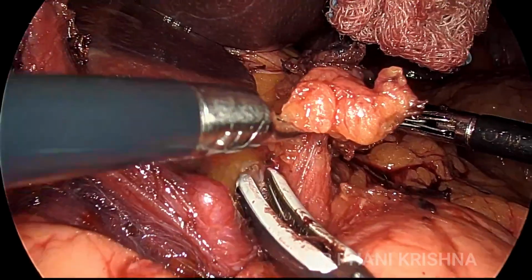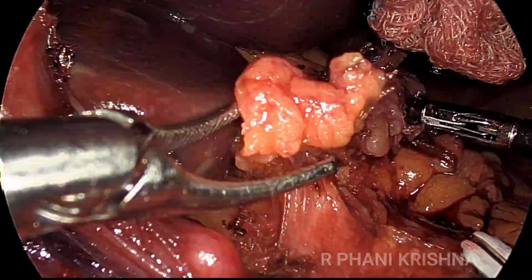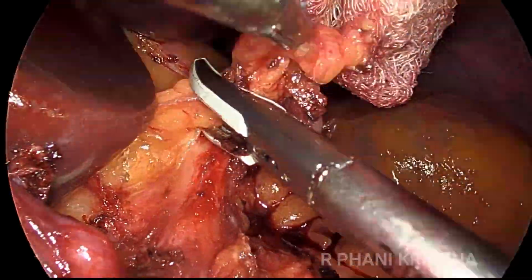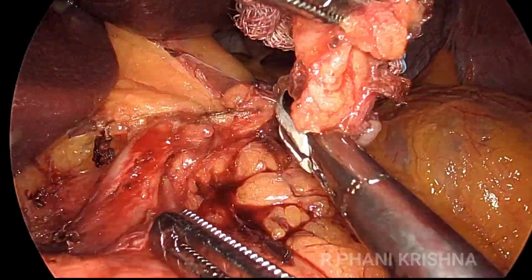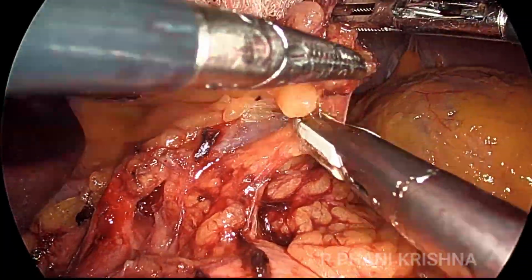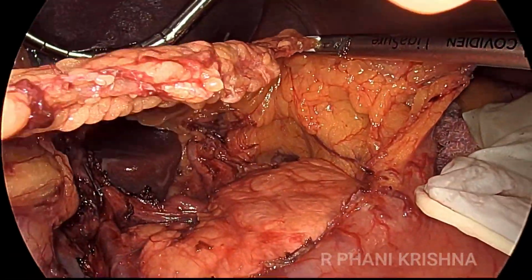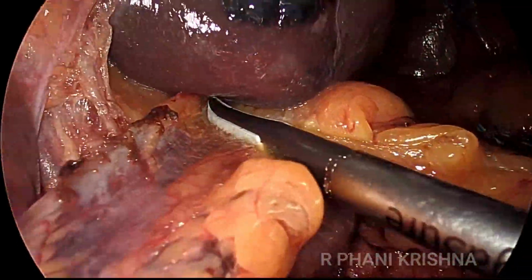That's the lymph nodes and the lymphatics over the left gastric artery, which indicates that we've reached the lateral end of our dissection onto the celiac origin. So progressively the nodes at the origin of the left gastric, the common hepatic and the nodes of the celiac origin are being divided, and the lymphadenectomy on the left side is completed.